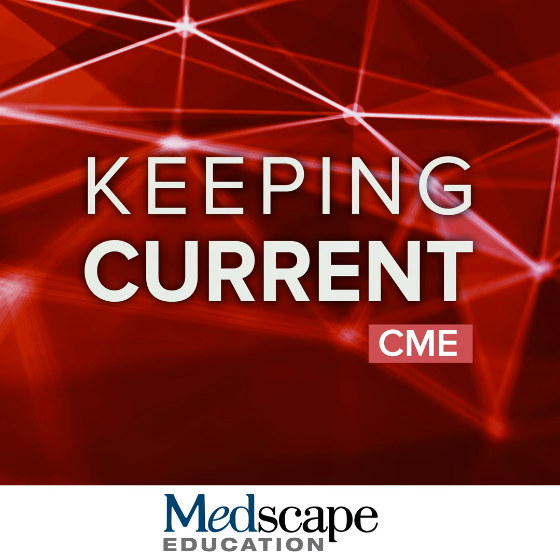And this was used as part of decision making for switching to maintenance dosing or stopping therapy. It's very common for both of these therapies in the US for an amyloid PET scan to be ordered about 18 months into treatment. And this is where, for some clinicians, having the baseline in order to do a comparison to see how much change there is can be helpful. And so this is a very common practice that we're seeing right now. It's baseline PET and post-therapy PET ordered with a request not only for visual read, but for that Centiloid to help judge that response. And it is tricky to look at these after therapy.